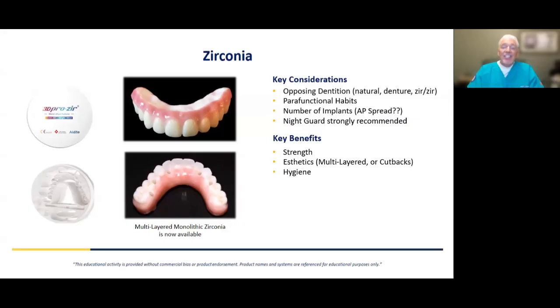I think hygiene's a big one here, because the pink is stained just like glaze on a crown. So for a patient who maybe has had issues with not the best home care, or plaque buildup, this is much easier for them to clean. Plaque doesn't adhere to it like it does to the other materials, and the nano ceramic coming up next as well.